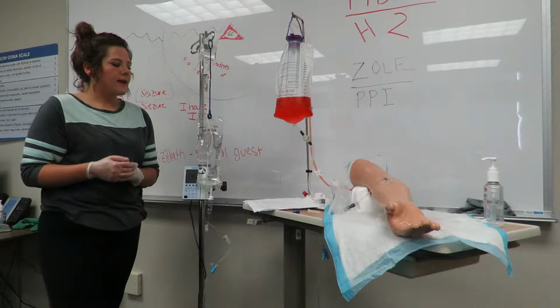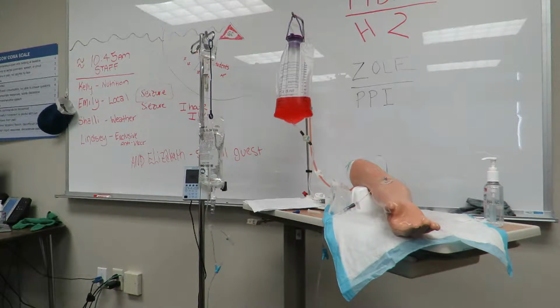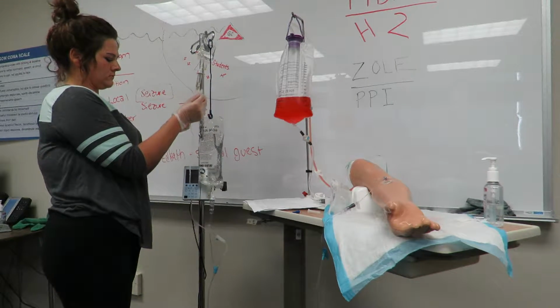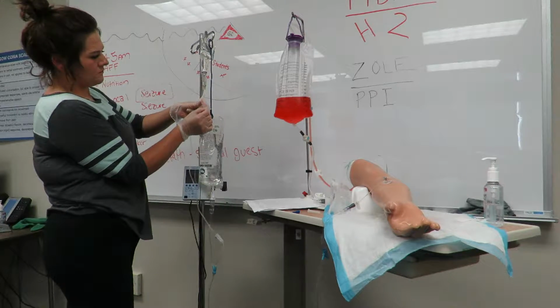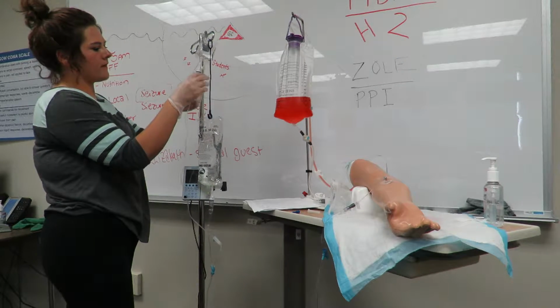Alright, and then I'm going to go ahead and label my tubing here with a piece of tape, noting the date, the time, and my initials. And I'm going to put that up here on my tubing. And I would document my findings with that.